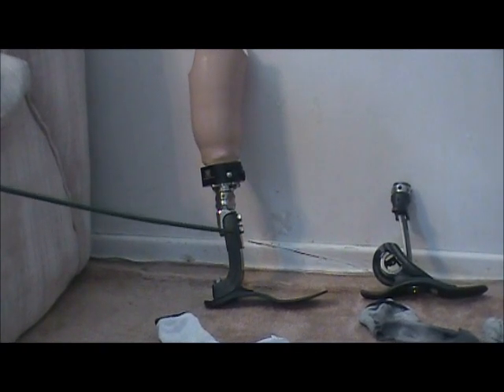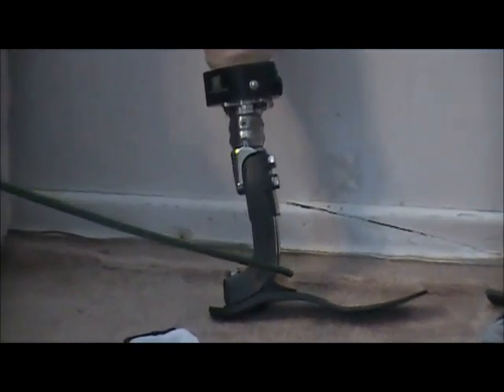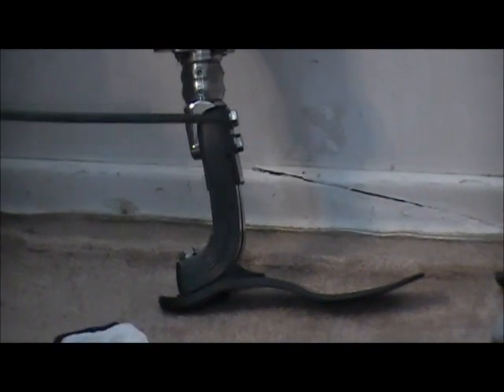This is an Ultra Stride foot. One of the main features is how thick and strong it is through here. This is a very similar foot to other graphite feet on the market, but made quite a bit stronger.